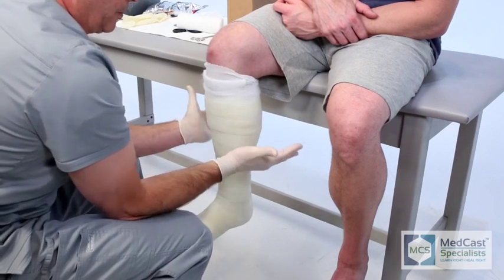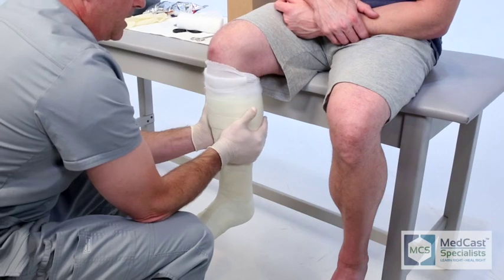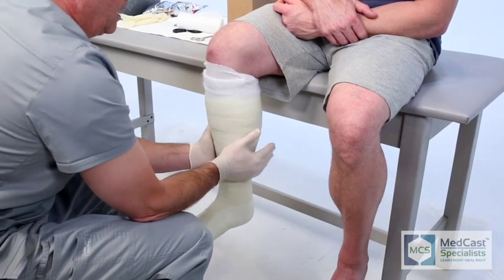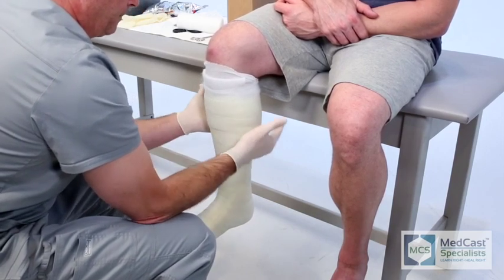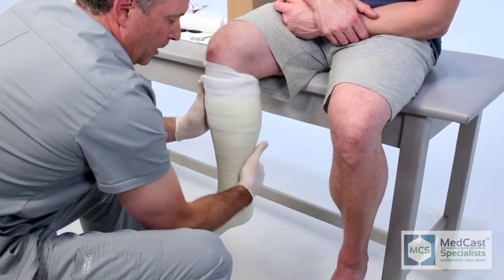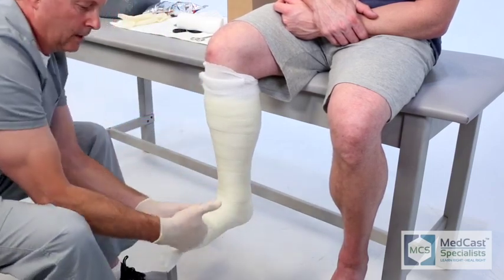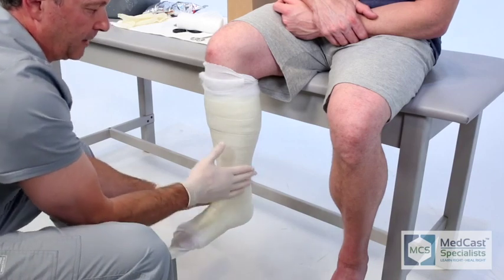Talking about Achilles, a lot of times you'll put on a short leg cast for an Achilles injury. The thing about that is you don't have to get them all the way up to 90 degrees, because on an Achilles injury they're going to be plantar flexed to allow the Achilles to heal. We'll do serial casting on them, coming back every week where you're actually dorsiflexing that foot up, slowly stretching out the Achilles to help with range of motion, while allowing them to heal the Achilles tendon rupture or surgery.